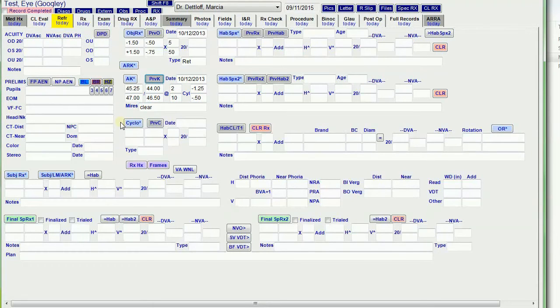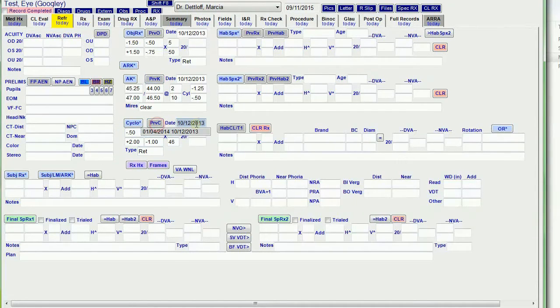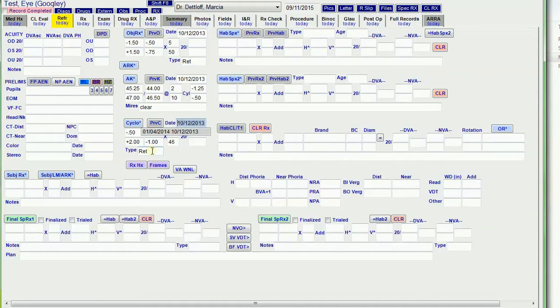So I have a cyclo button here. It pulls in the AR data, but I bring it into these fields so that I know that it was done under cycloplegia. And again, I can hit previous. It puts in the date and it tells me that this previous reading was retinoscopy.